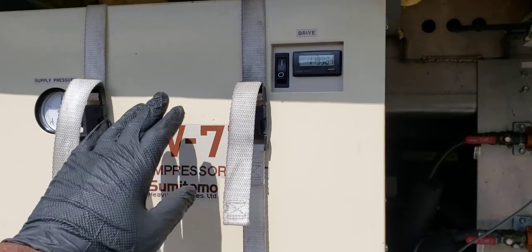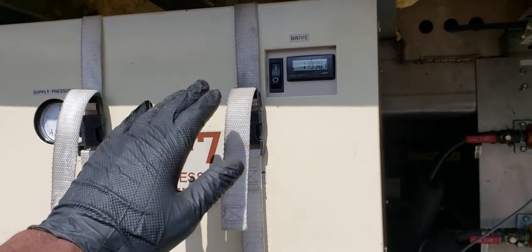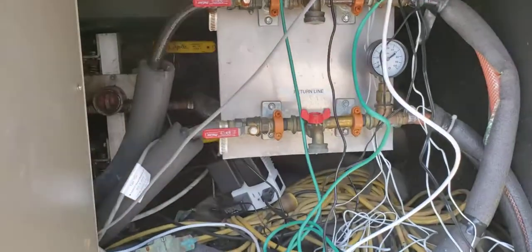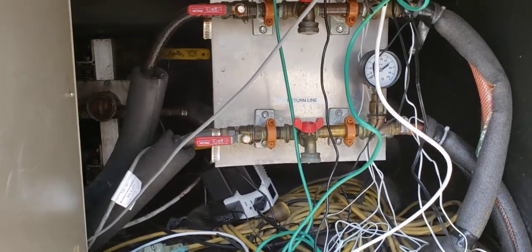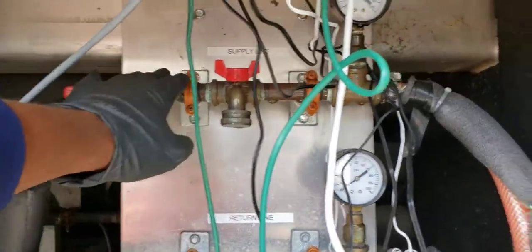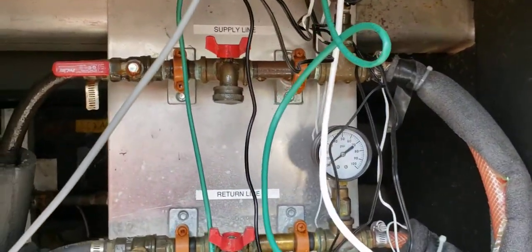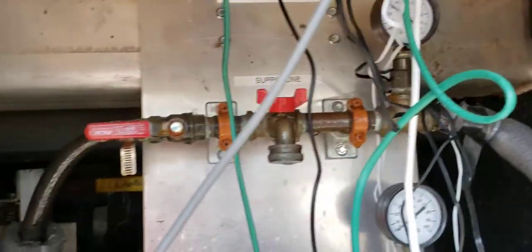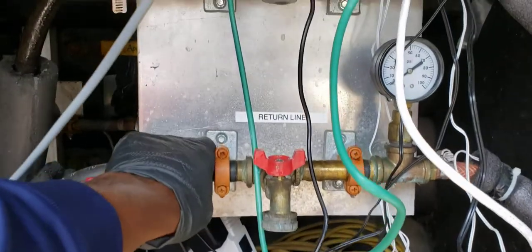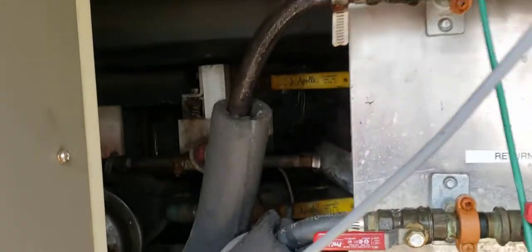This evaporator cools down the magnets in the MRI scan machine. Here we have the chill water that is attached to the chiller - as you can see, it is sweating. We have chill water and the pump back here.